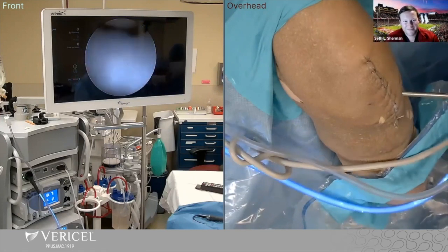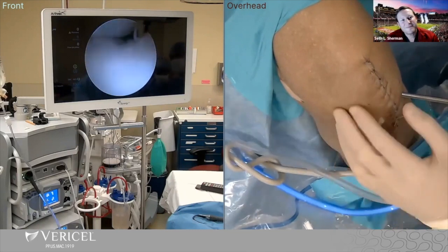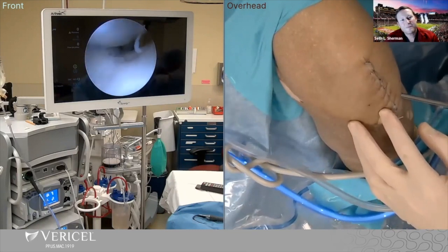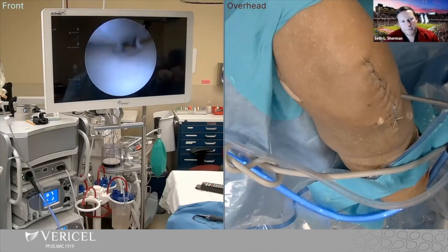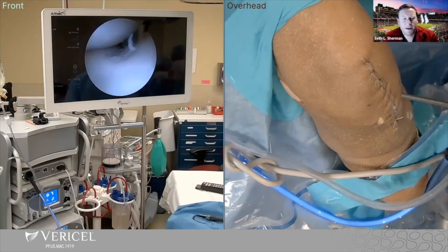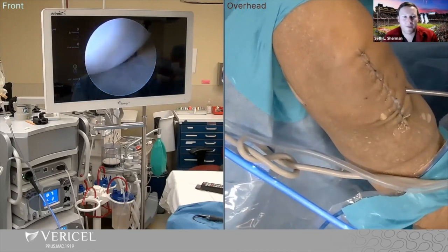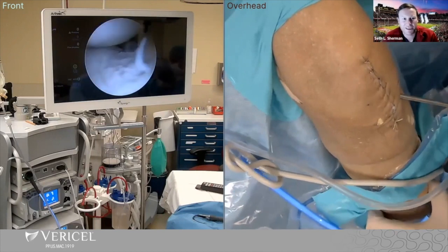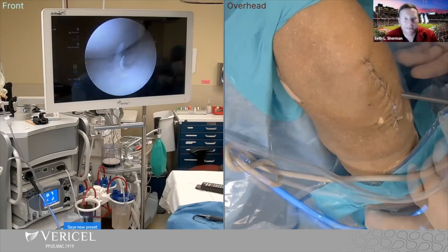One thing I like to do is take this picture at the end. I always show the trochlear defect and then I show this picture right here — it kind of looks nasty, it's really going onto itself. That really brings it home to patients: that defect is really loading onto the cartilage. When you have a kissing lesion with defects on both sides, you can really see how they interact with that photo. I also like to do a dynamic MPFL exam, look at lateral retinaculum tightness, and use a 70-degree scope from above to look down at patellofemoral tracking. In this case, it's an isolated central trochlea without any concomitant malalignment — correct? Correct.